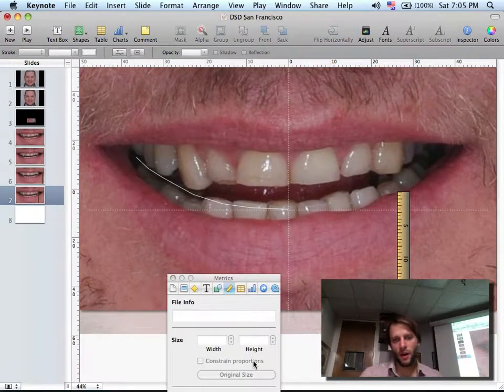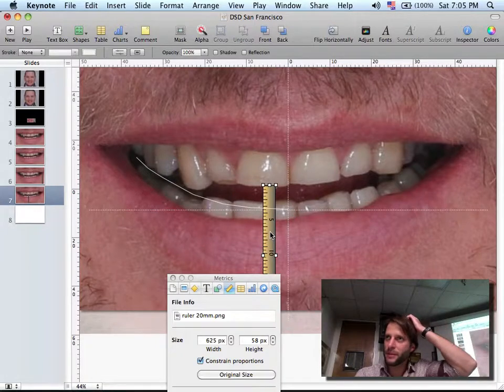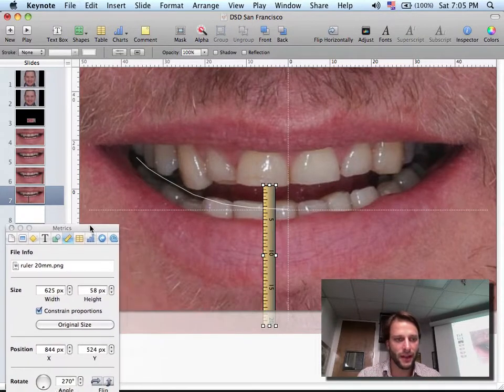So now that we drew the first one, you can actually go back and measure. So in my case here, I'm lengthening 3.5 millimeters the central, and if I go back to his video, it makes sense. Okay, with the amount of erosion and abrasion and no exposure at rest, etc., 3.5 millimeters is not something impossible. So I'm fine. I'm happy with my first guess here.